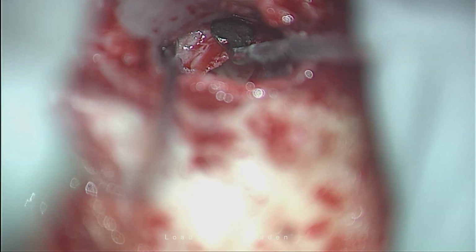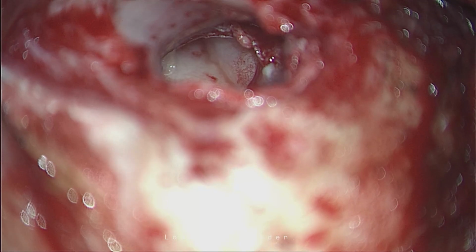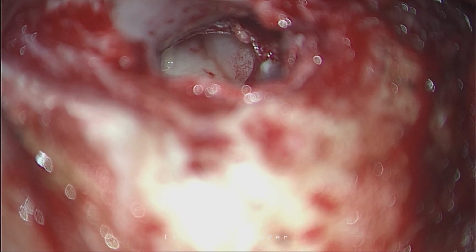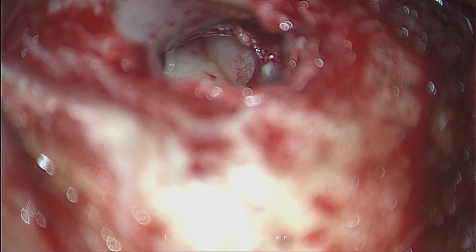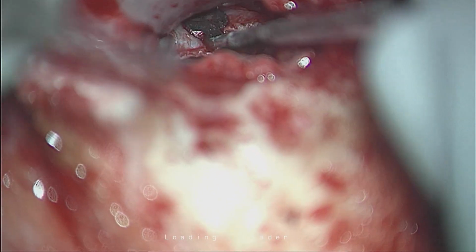One of the delegates wants to know if it would have been a small perforation in the posterior part, would you still have been doing the same technique? Not really. In our practical scenario, we follow a variety of tympanoplasty techniques. This kind of surgery is aimed at addressing subtotal perforations or large central perforations. In small posterior perforations, you can do a simple underlay with some sort of tucking anteriorly, or an over-underlay involving the malleus for support, or inferior tucking. You have to ensure that your graft is well tucked. This technique is best suited for subtotal and large central perforations.